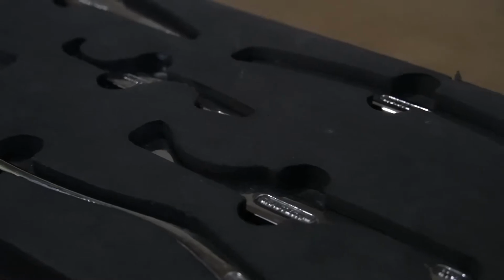With Graston Technique, there's 6 different medical instruments. With those instruments, we work through the tissue, looking for different spots of redness. As your body identifies where it is tight, it identifies it with red. So we can see, as technicians, what we can work on and work through.